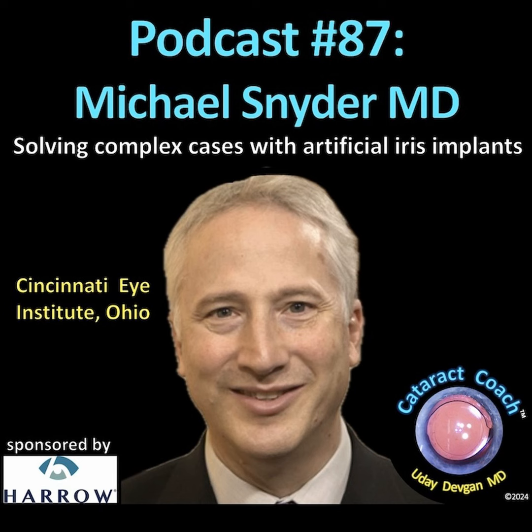When Bob Osher did the first implantation of the Morcher and Iridia rings, he and Ken Rosenthal both did those first set in 1994. And then Bob and Ken and others set up a study through the Morcher folks so that we could access it through compassionate use. Those patients really did pretty darn well functionally, but they didn't do perfectly because the apertures were still pretty large. It was still 6.5 millimeter openings, and the devices were black, so it didn't really change the overall appearance of the eyes either. So, we were constantly looking for different options that were available.